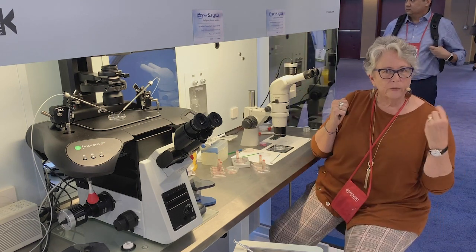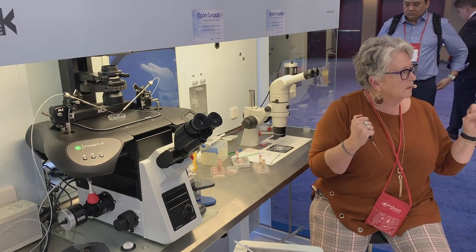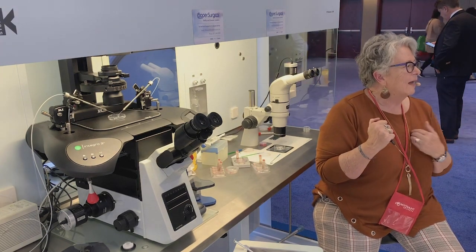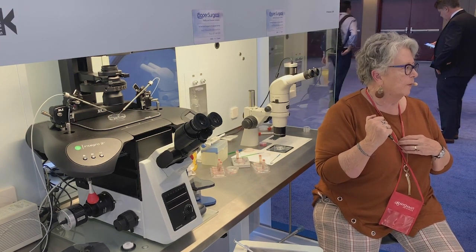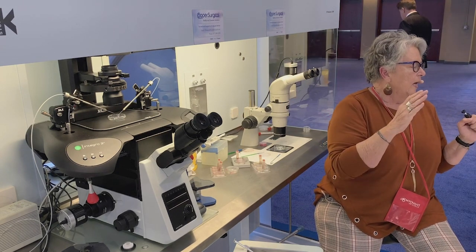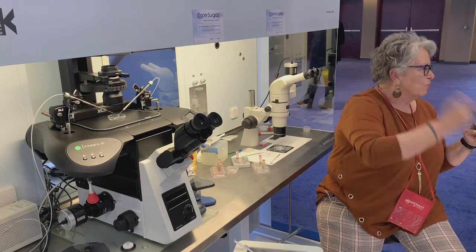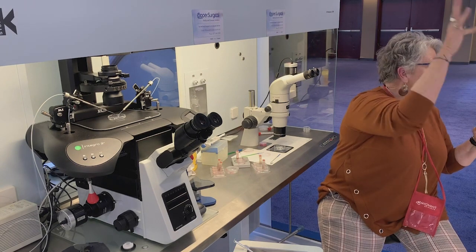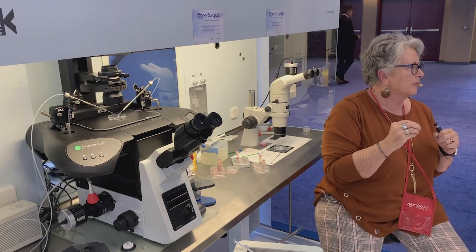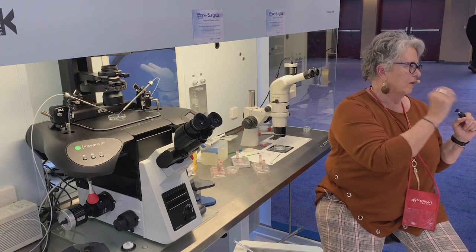So then the next issue is, let's get them onto the device. If any of you have used a CryoLock device, the VitriGuard is very, very similar to the CryoLock, which I love. We have used the CryoLock for many years. One of the things we did with it is we put embryos on and threw this device around our lab. We knocked it on the bench, we threw it against the wall, we dropped it on the floor to see if we could dislodge the embryos. And we could not do it. So the embryos stay on the device.